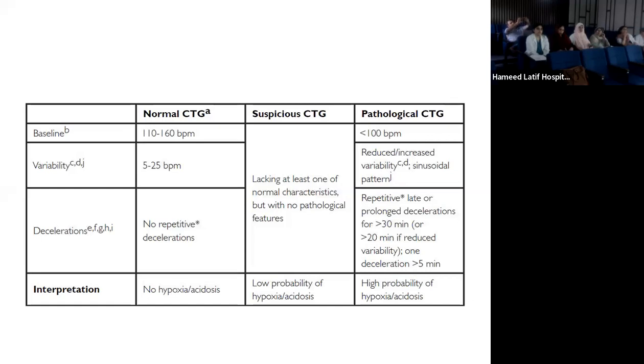Plastic, there is this. You put it inside the vagina. Then you're looking, then somebody places the light behind you, and then you see inside, and then you actually see the cervix, this dilated, and from in between you see the baby's head.